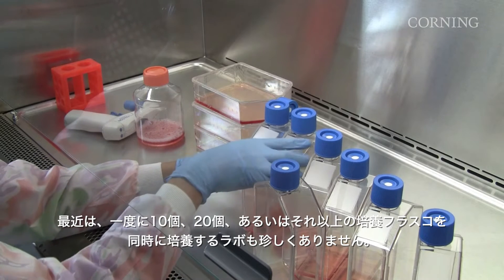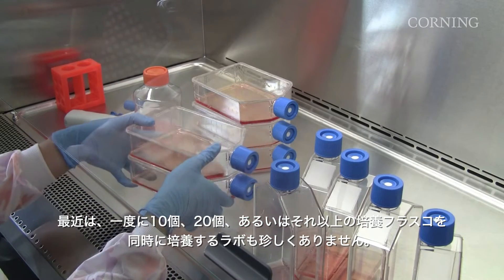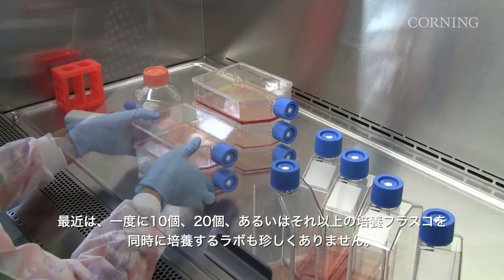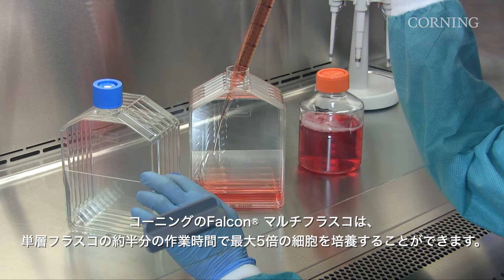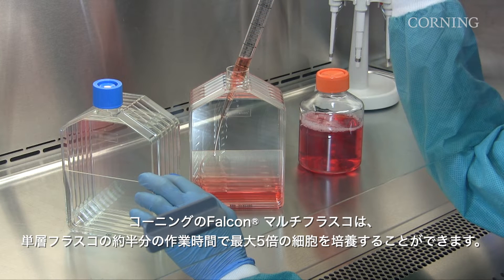These days, it's not unusual for labs to simultaneously prepare 10, 20, or more culture flasks at a time. Falcon Multiflasks from Corning let you culture up to 5 times more cells than a single layer flask in approximately half the time.